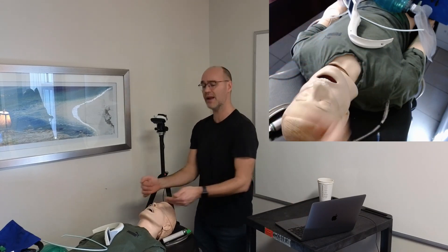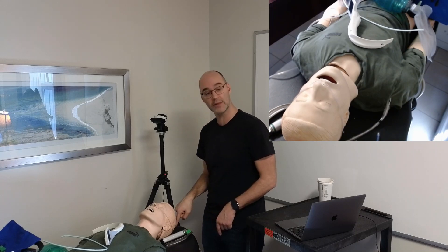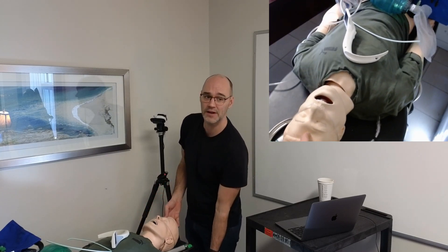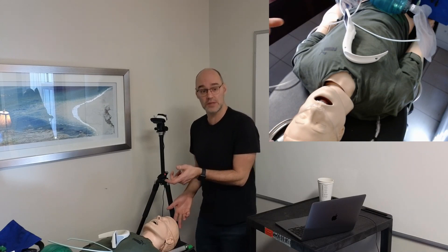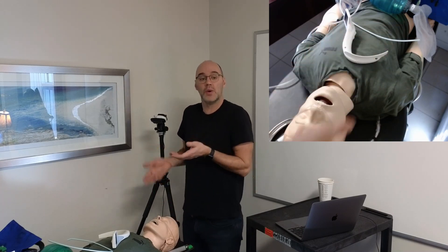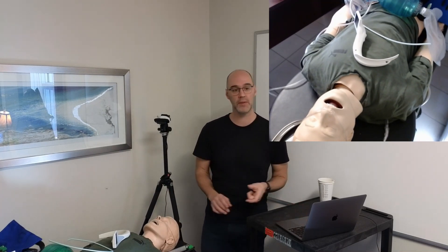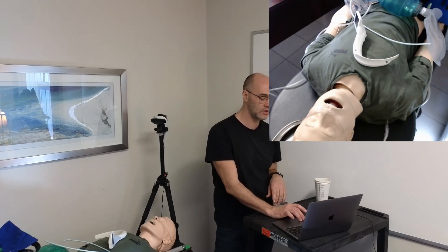For provider positioning, place the patient's occiput right at the top of the bed so you can easily manipulate the head. The patient's nose in sniffing position should be below your belt line — it's easier to come down a bit than to be too high. What I see too often is the provider stretched too high, and when they do head lift they can't see. Your assistant is typically off to your right side so they can hand the tube into your right hand and perform maneuvers as needed.